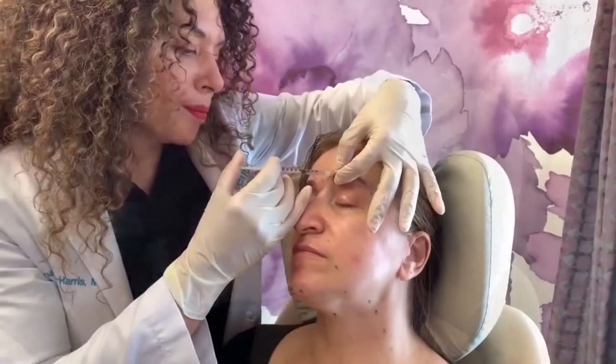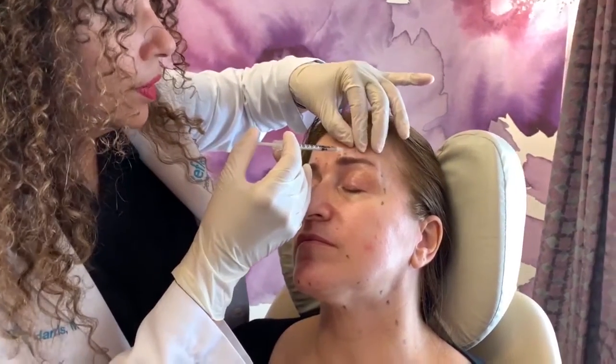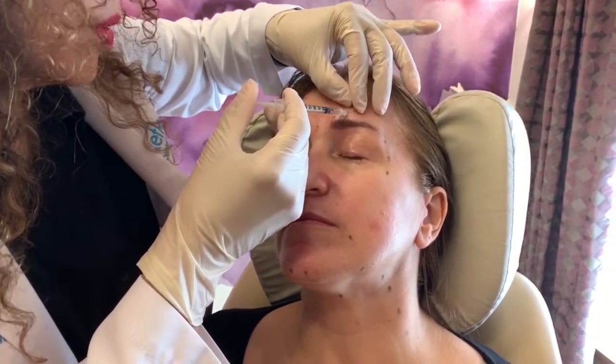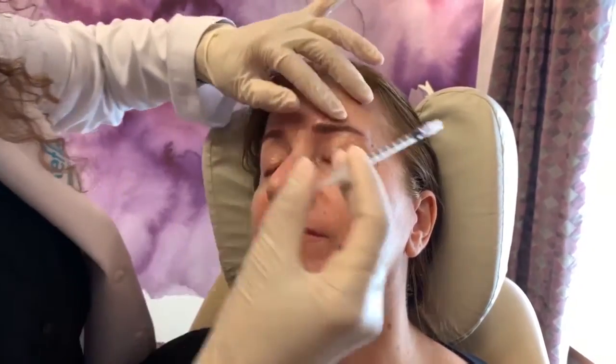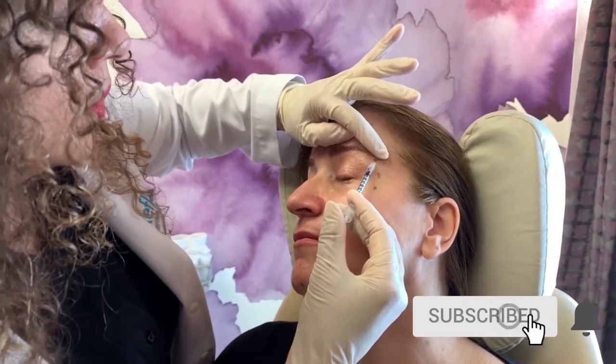As you can see, I've marked this patient for treatment with a surgical marker in all of the spots that we're going to inject. I start with her forehead and around the crow's feet before moving on to her chin. See how easy and quick the injections are.